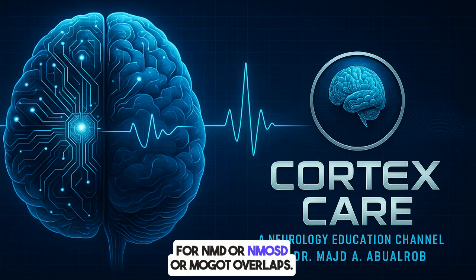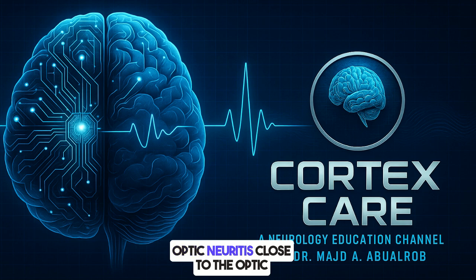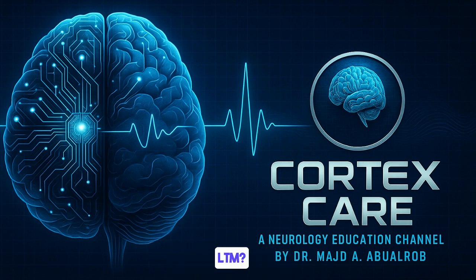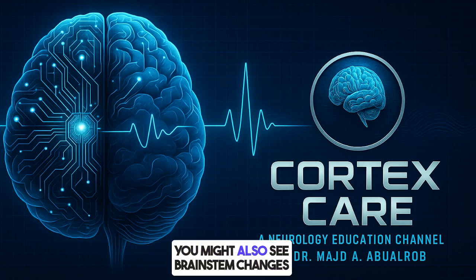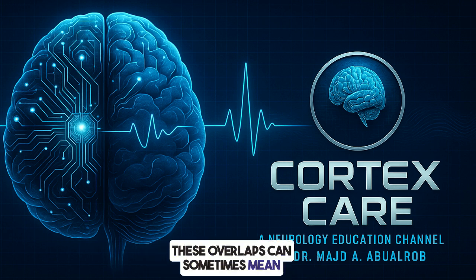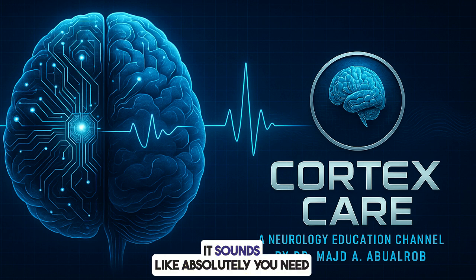For NMDAR, NMOSD, or MOGAD overlaps, the MRI might show things like optic neuritis close to the optic chiasm, or longitudinally extensive transverse myelitis, LETM. LETM, that's the long lesion in the spinal cord. That's the one. Long section of inflammation. You might also see brainstem changes or other white matter spots. These overlaps can sometimes mean more lasting deficits for the patient. So recognizing these patterns on MRI is pretty crucial for treatment decisions, it sounds like. Absolutely. You need to treat both aspects potentially.